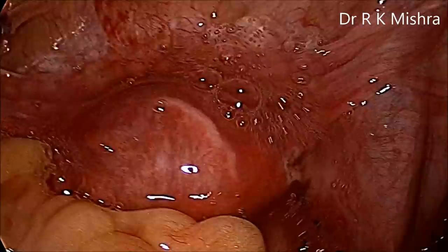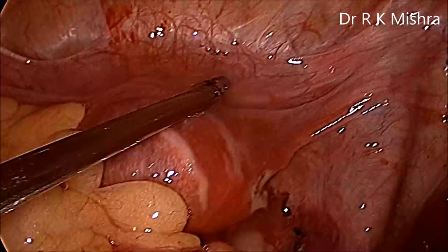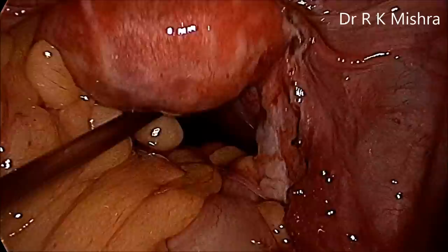Whatever blood is remaining is sucked out. The procedure is now over and the port is closed. Thank you very much for watching this video — this was just a simple case of right-side ectopic rupture. Have a nice day.